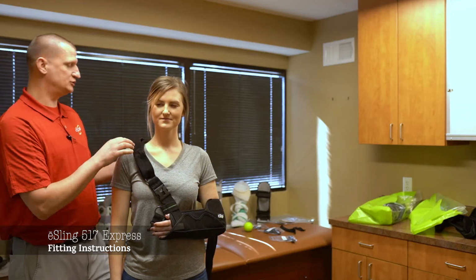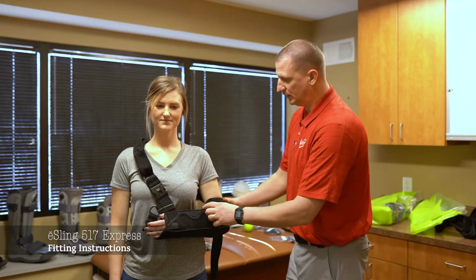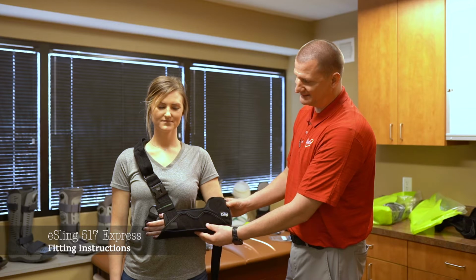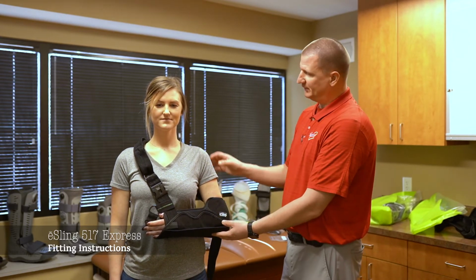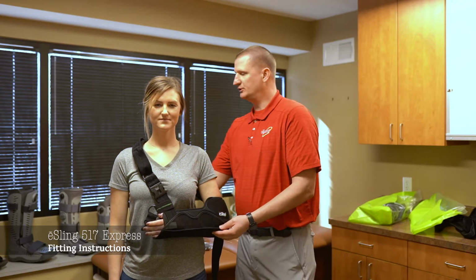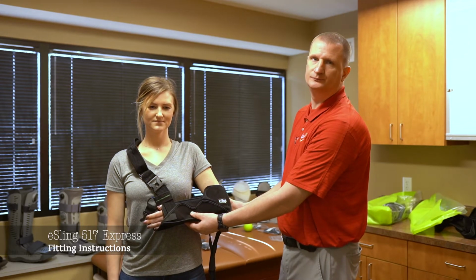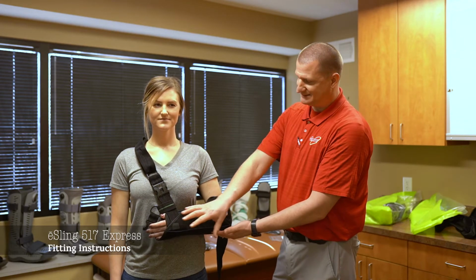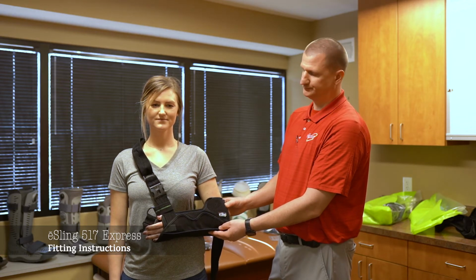When this is positioned, okay, her elbow should be at 90, her elbow should be all the way back into the cradle, and her arm should be relaxed down into the cradle part of the sling. This sling should not feel like it is hiking her shoulders up, or what we call a shoulder shrug. Sometimes a fitter can pull these straps too far and it actually drives her shoulder up. Okay? So we'll always recommend to the patient, make sure that they're relaxed down into the cradle, but yet at the same time not feel like it's shrugging the shoulders up.